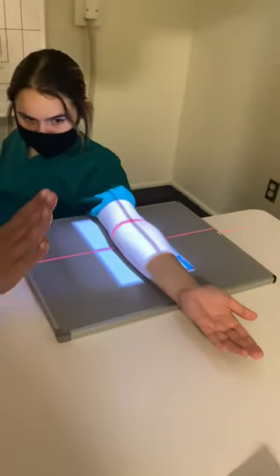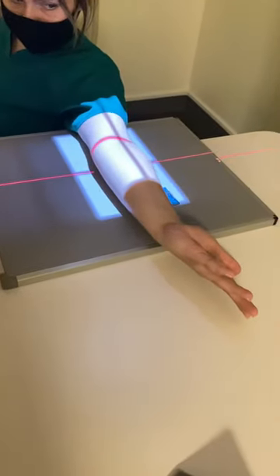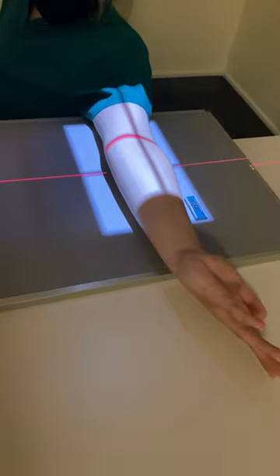For the external rotation, I'm going to have you roll out so that your thumb's touching the table. I'm going to move to re-center over the mid-elbow, have my patient hold nice and still, and take the image.